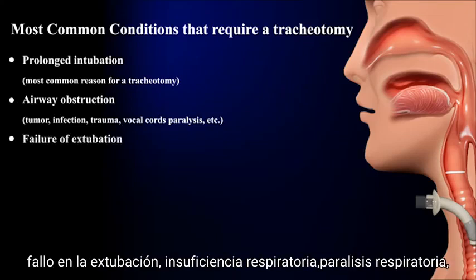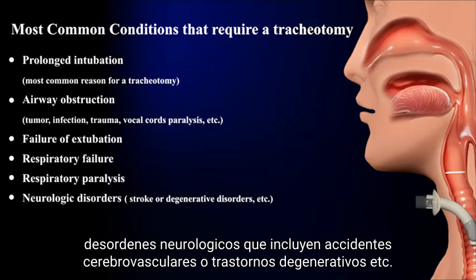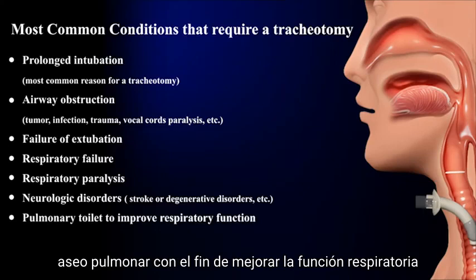failure of extubation, respiratory failure, respiratory paralysis, neurologic disorders, with conditions that include stroke or degenerative disorders and others, and pulmonary toilet in order to improve respiratory function.